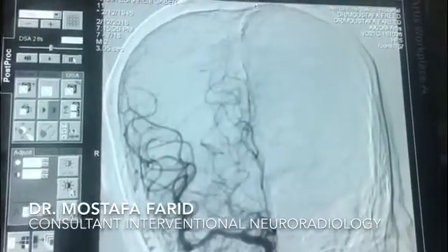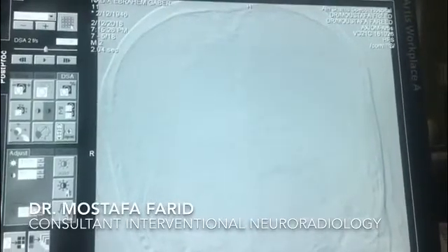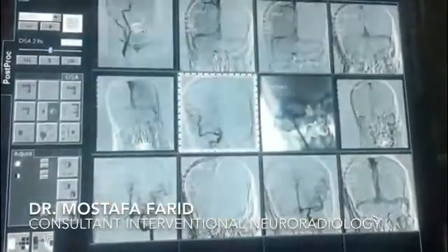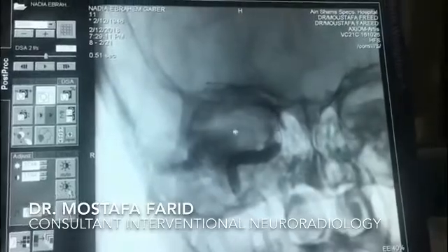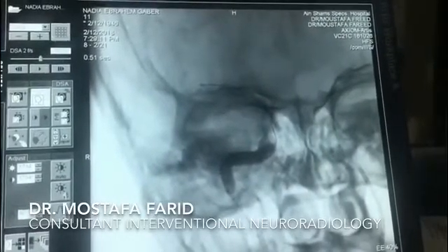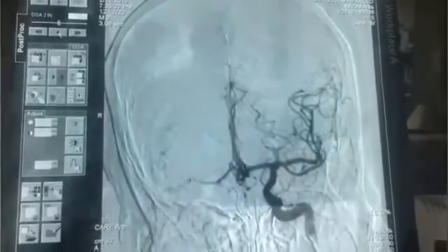What I did is occlude this artery with the balloon, then performed the balloon occlusion test by injecting contrast dye through the left side.